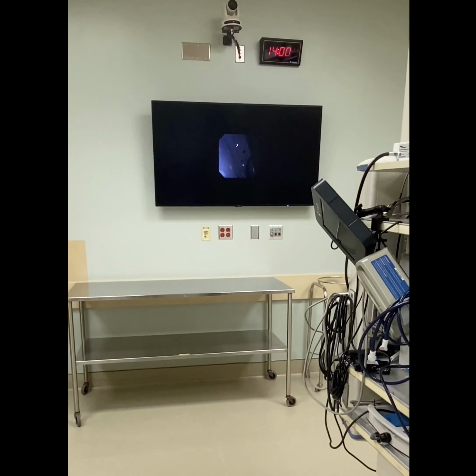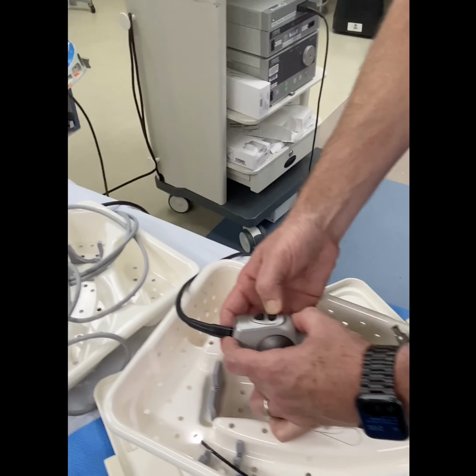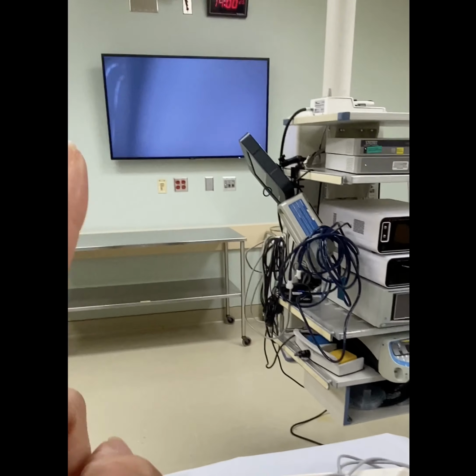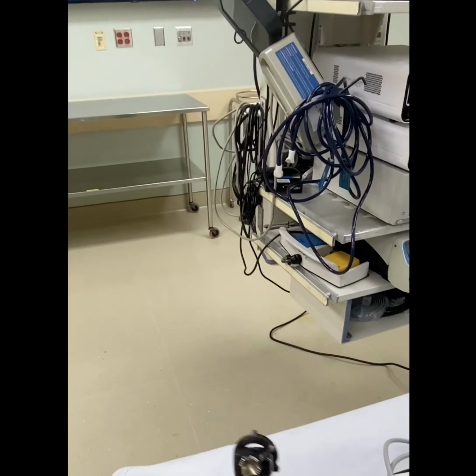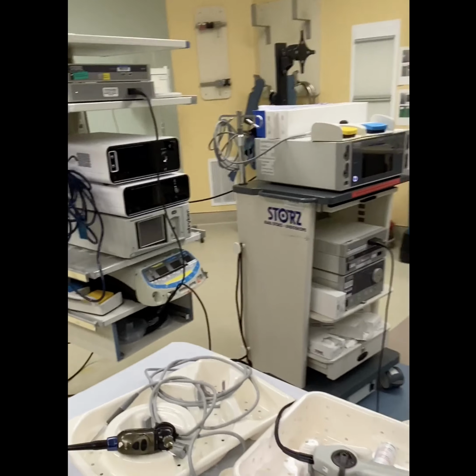Once they're done with the digital ureteroscope and say, hey, I want to go back to my regular cystoscope, you should be able to push the top left button on this too. Okay, let's see. You're going to hit the top left button on the digital ureteroscope to go back to your cystoscope use. And that is how you use the digital ureteroscope and hook it up.